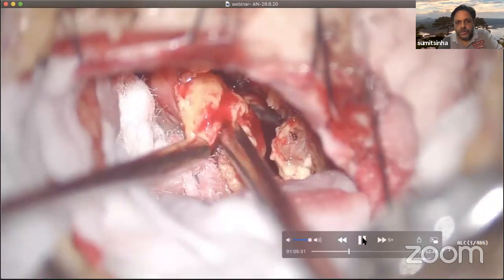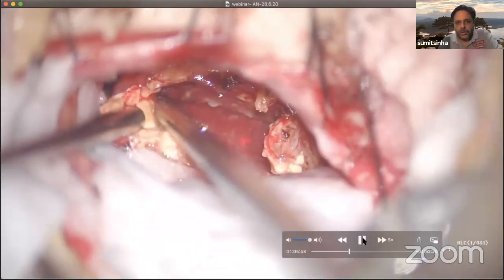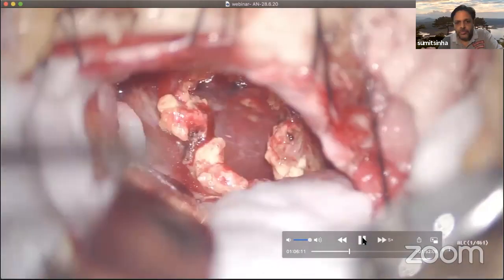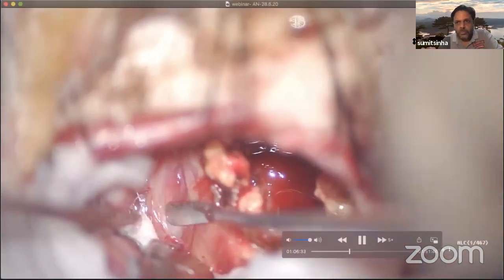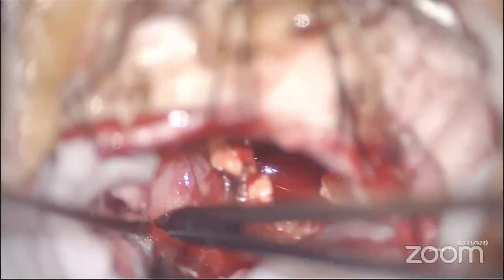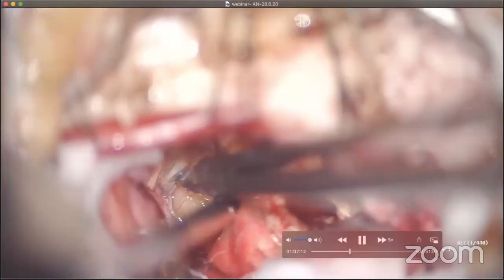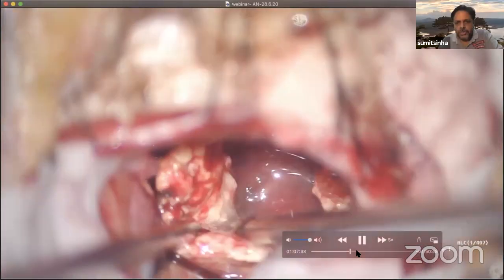So now decompression of the superior pole. More debulking.